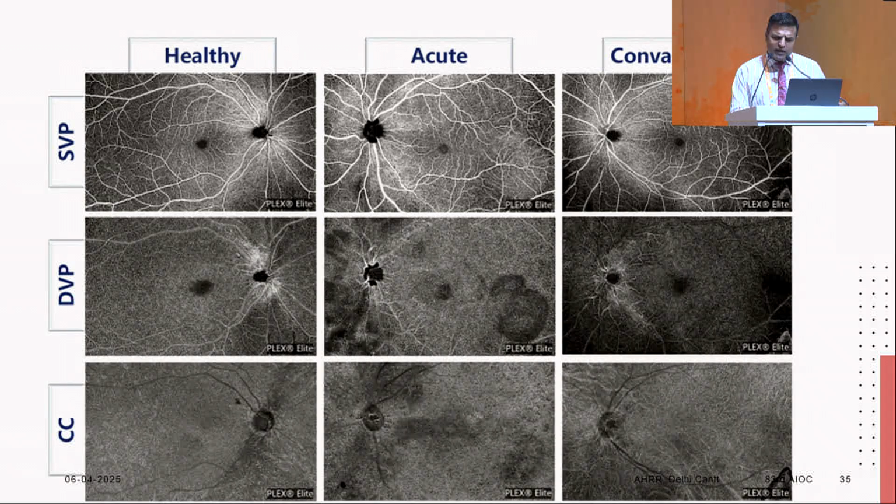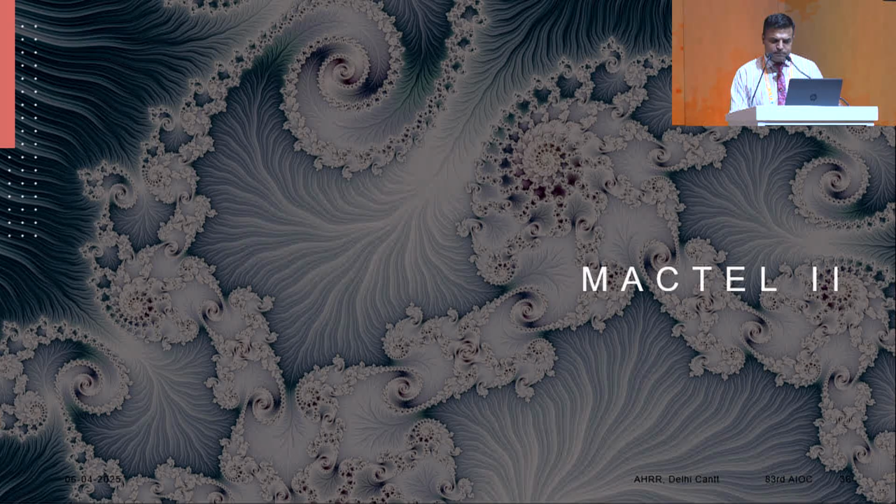systems for Vogt-Koyanagi-Harada based on OCT angiography images. The presence of flow void areas in the choriocapillaris segment or the deep capillary plexus segment tends to correlate with active disease, compared to a convalescent disease where the earliest sign is the disappearance of these flow void areas in the choriocapillaris segment.